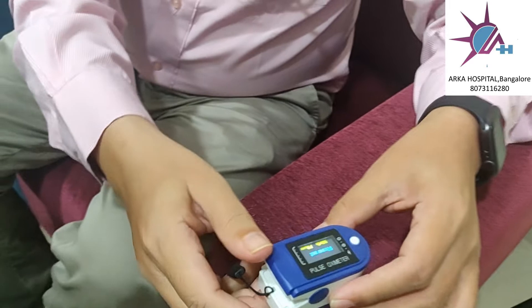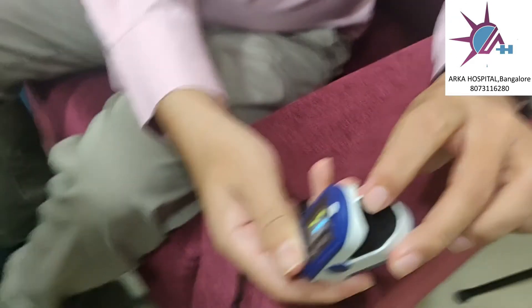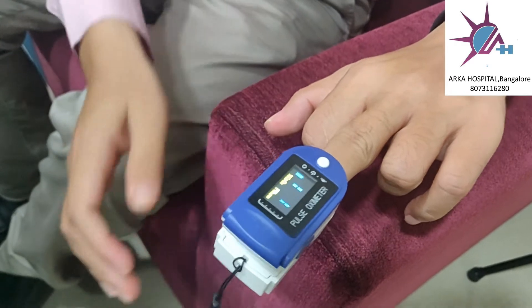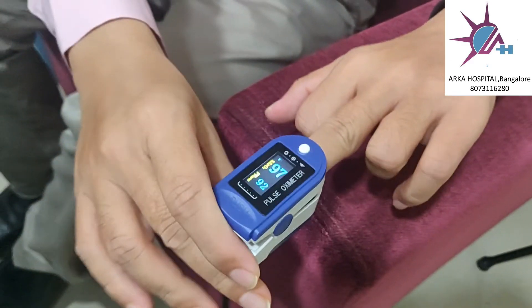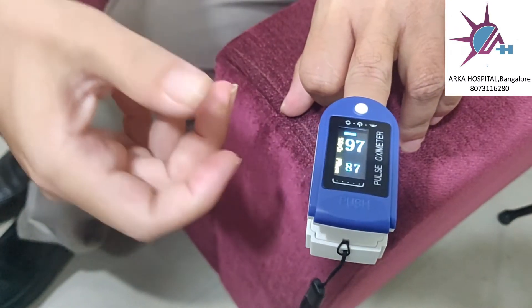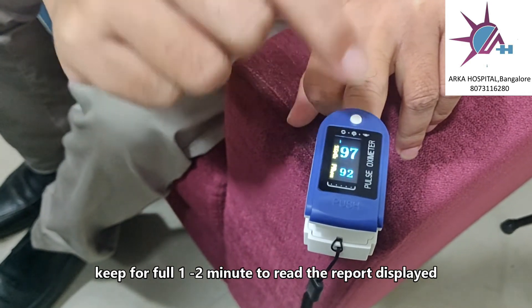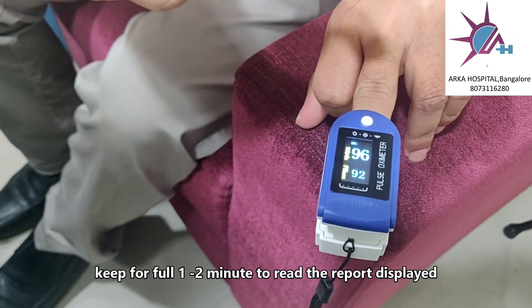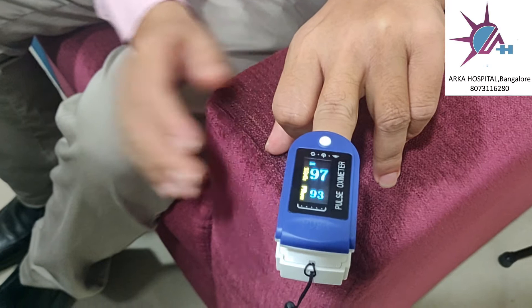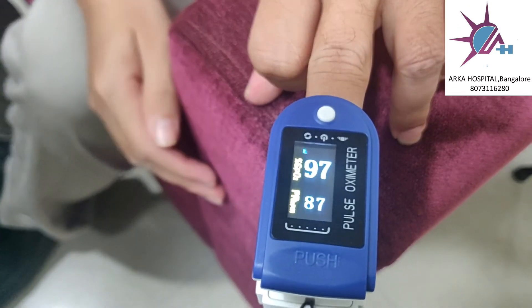When you switch on the pulse oximeter, there will be a light inside. You have to go straight like this and keep your finger in it and switch it on. Many people remove it immediately — you should not do that. You have to keep the finger for at least a minute before you finalize your readings.